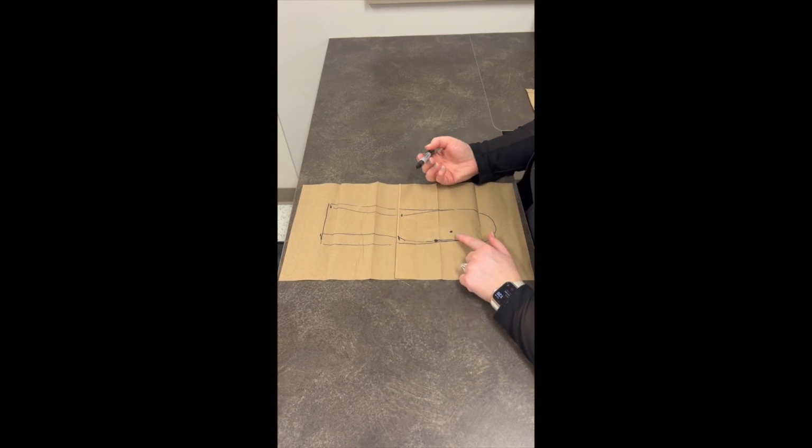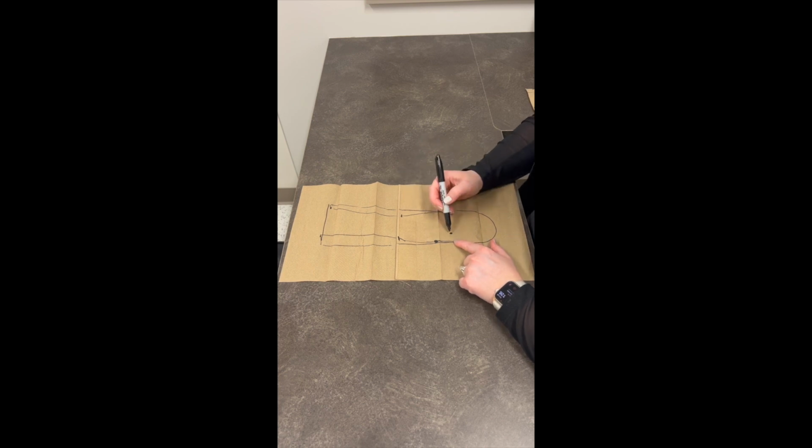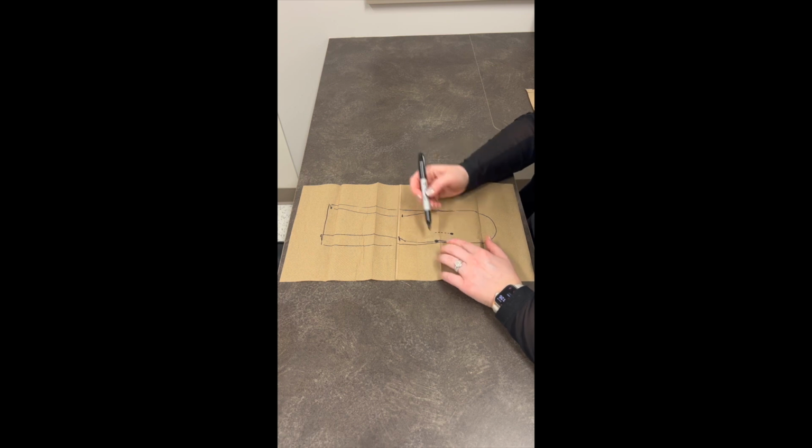Now we'll be working on the cutout for the thumb. So we're going to start with the dot that we made in the first web space. So we're going to make a dotted line extending down. And once it's in line with the dot that you made on the first web space, then we will stop.